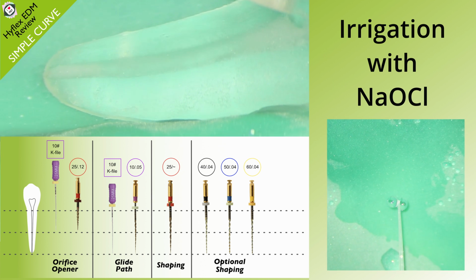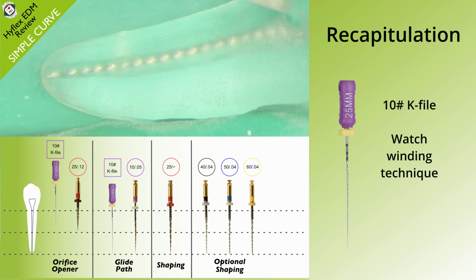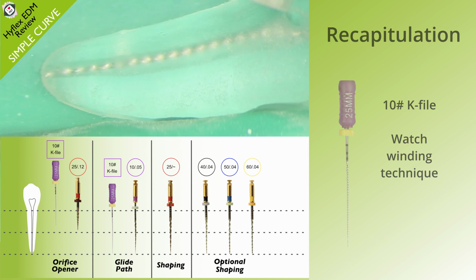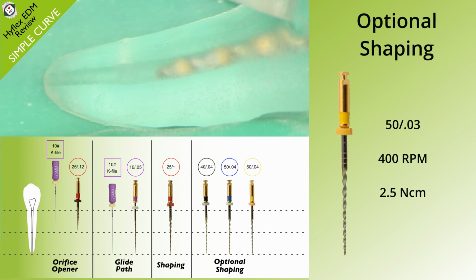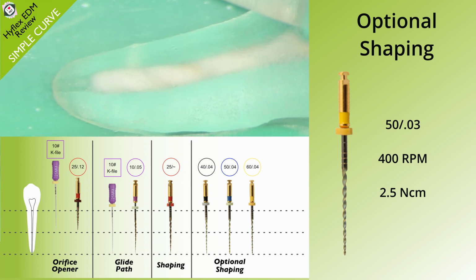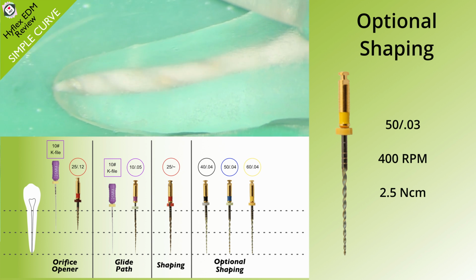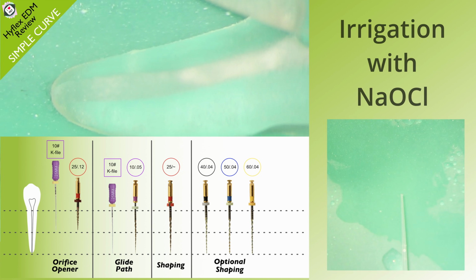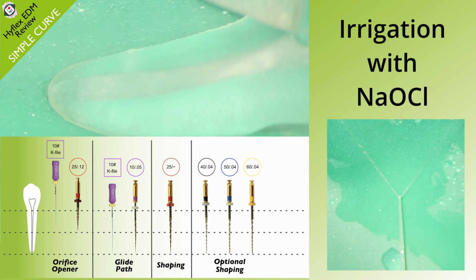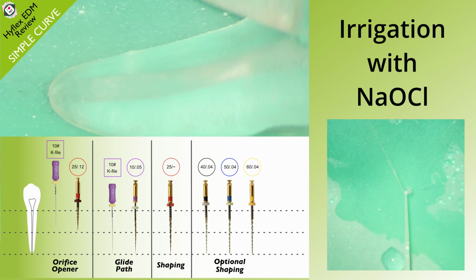Lots of irrigation. And recapitulation, make sure you get all the debris out. Again, the next file up, it's huge, it's a size 50/03, and just look at the dentine destruction there. You know, I would probably say that this is probably excessive. And again, all the debris there, and you just need to get it all out with irrigation.